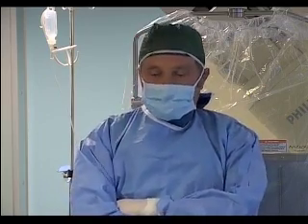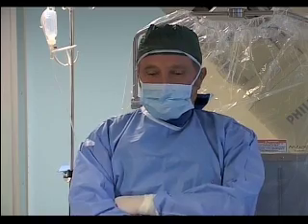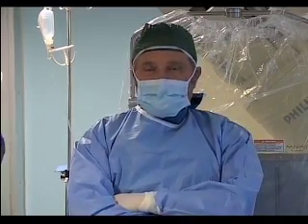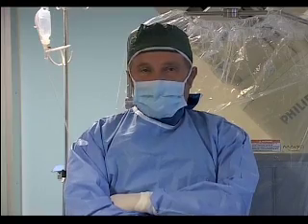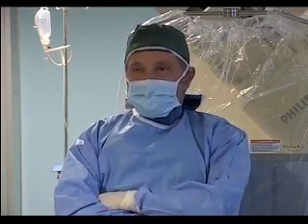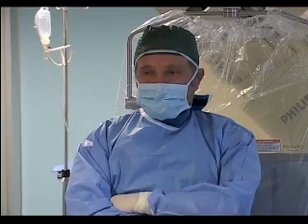What do you think? Do you think that the length of the ADO2 will not protrude too much onto the pulmonary artery if you put the disc onto the ampulla? Well, pretending we are going to use ADO2 AS, I think the central waist, in my opinion, should be, hopefully, sitting exactly in the ampulla. What do you think? I agree.